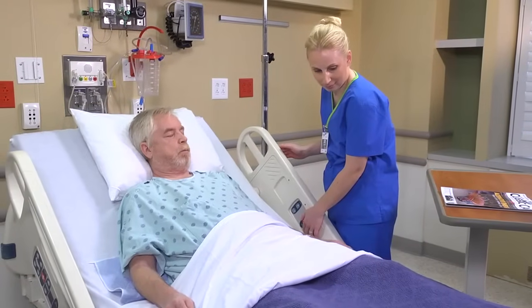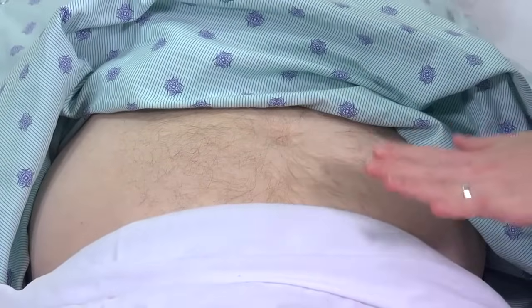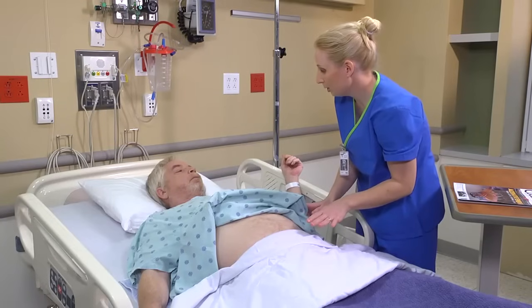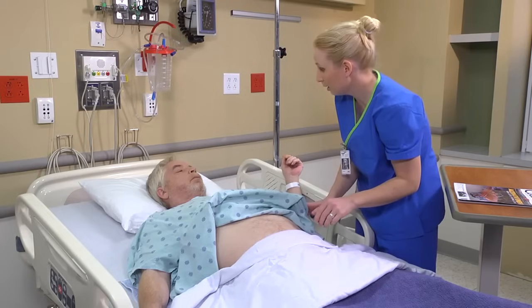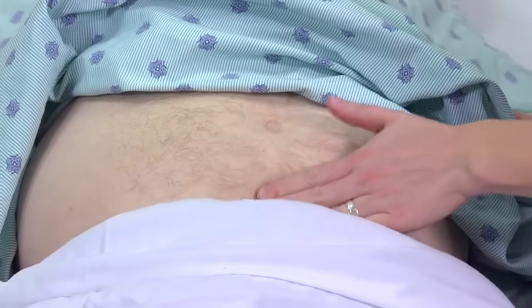Lower the patient into a supine position. I'm just going to gently press and palpate to make sure nothing is hurting or distended in your bladder. Then palpate the patient's bladder for distension and tenderness.